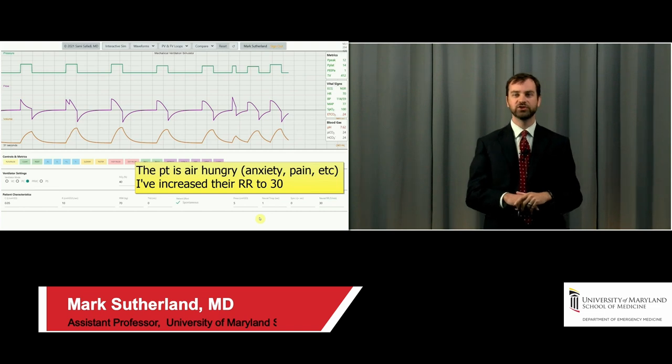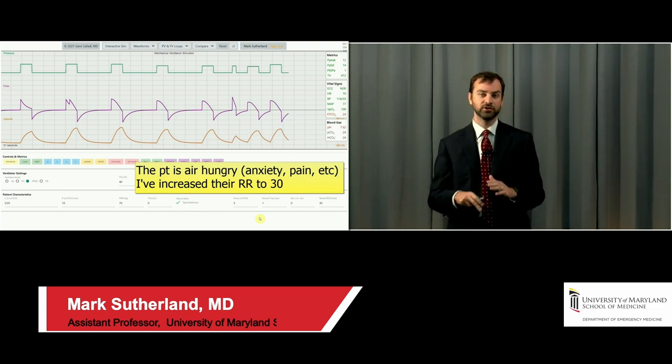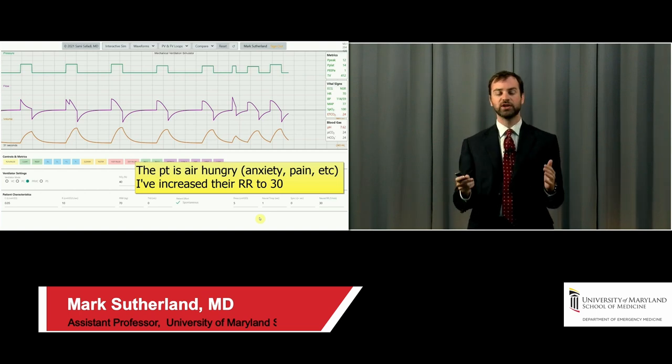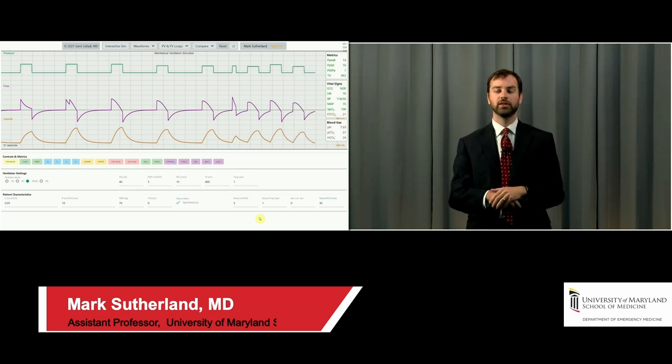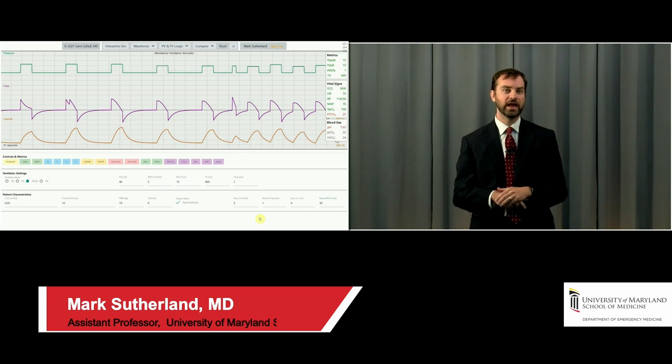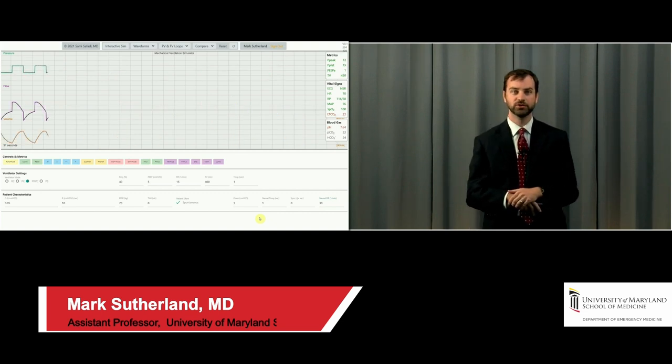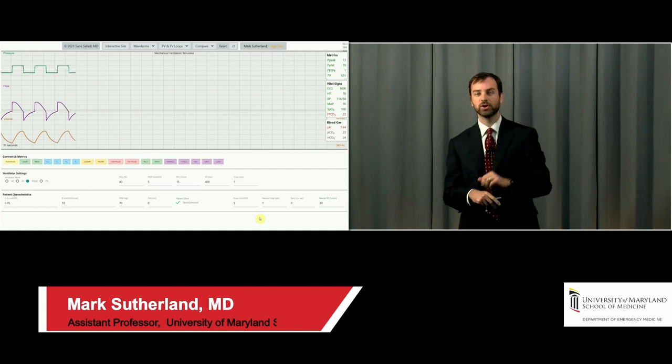But let's say our patient's air hungry. They're anxious, they're in pain, they're delirious. Ashley's talk before was very apropos. This is a situation where patients are waking up, they're at high risk for delirium or agitation, and they're often tachypneic and drawing high tidal volumes. So thus far we're doing okay.